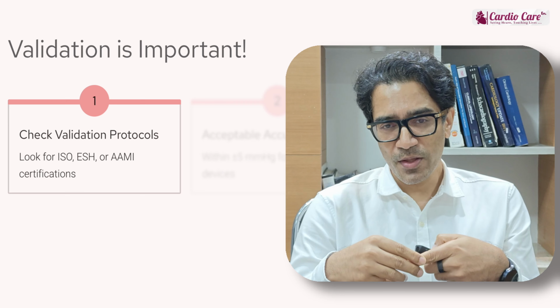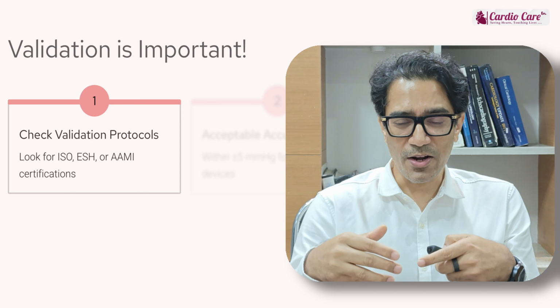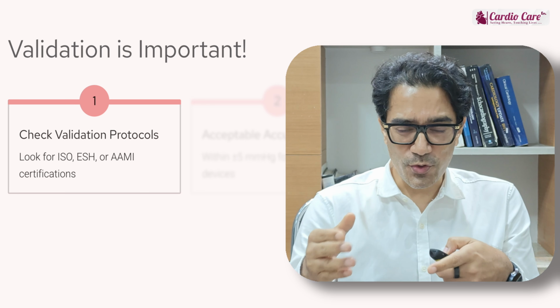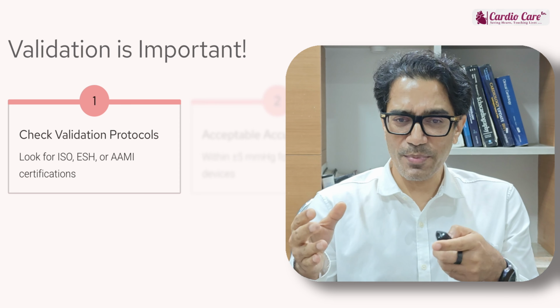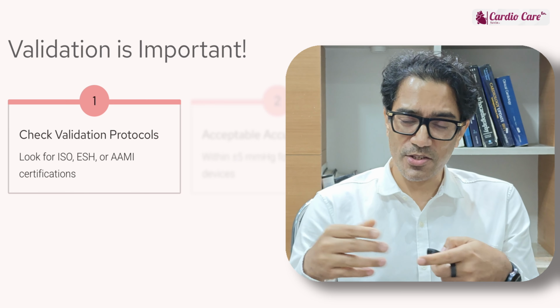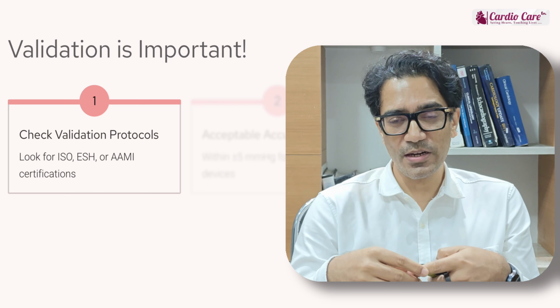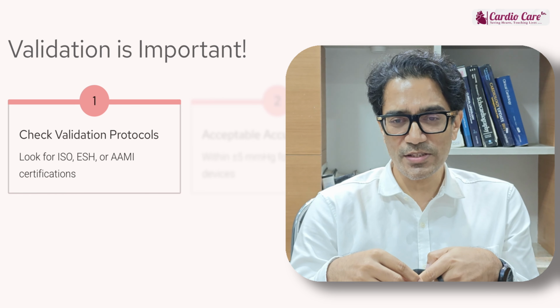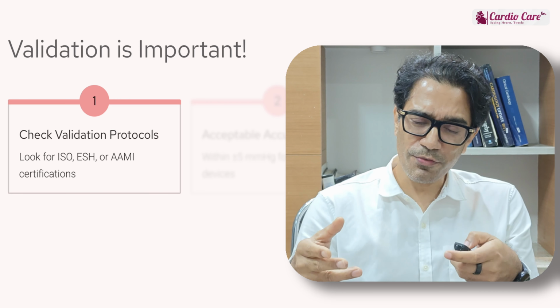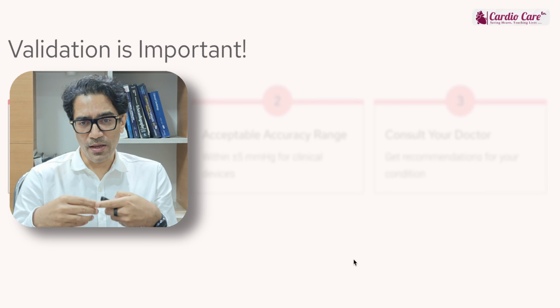look for validation, because all brands are not the same. There are quite a few brands in the market which are cheaper, but they are not validated by various validating agencies, like ISO certification or AAMI certification, the Association for the Advancement of Medical Instrumentation, or ESH certification. ESH stands for European Society of Hypertension. So either ISO certified, ESH certified or AAMI certified. If at least one of these three certifications is there for that particular brand, then you can go for it, because there are lots of digital monitors in the market which don't have a certification, and these uncertified devices may not give a correct blood pressure reading.